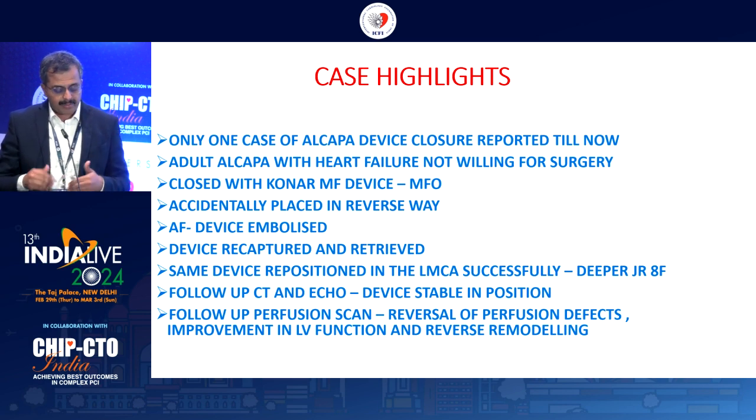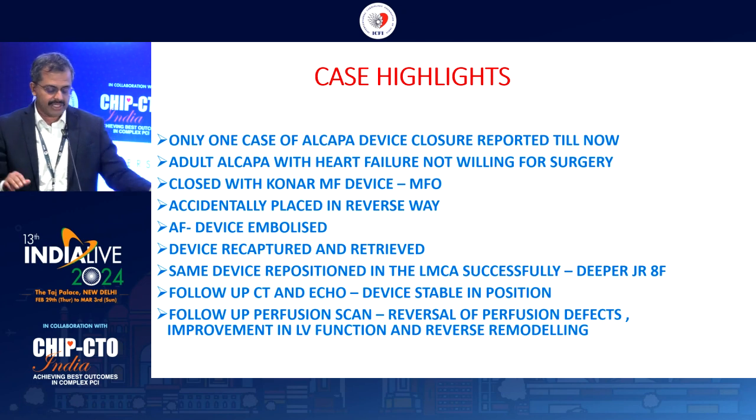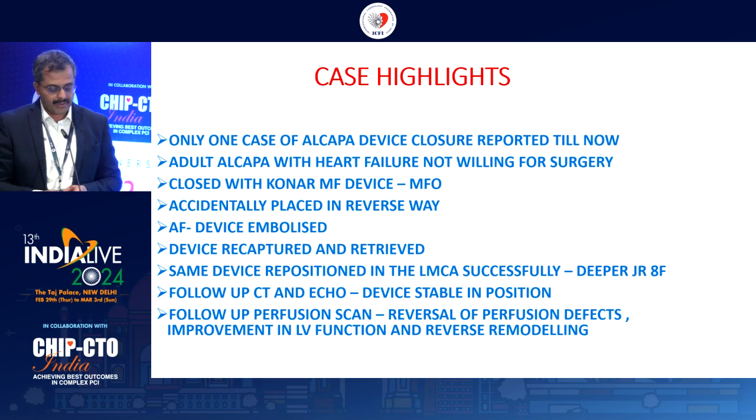The same device was positioned much deeper in, and to prove a new concept, we have followed up with the CT, a check angiogram, and a perfusion scan to show that there is reversal of the perfusion defect, improvement in the LV function, and reversal of the remodeling process that has happened in the LV because of Alcapa. So, thank you. I think it's an excellent and exotic case.